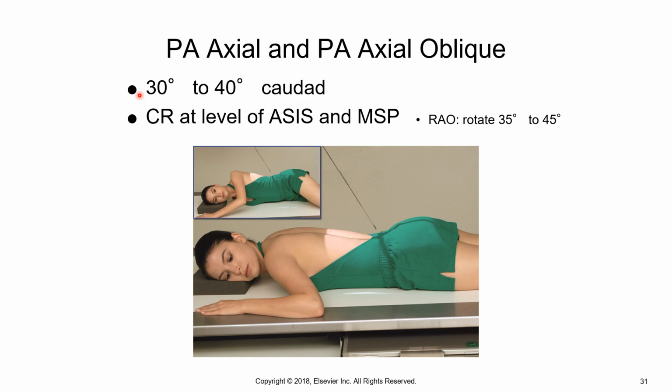And anytime something is opposite, because we just angled 30 to 40 cephalic, when you flip the patient, you would flip the angle. So now we're 30 to 40 caudal if we did this. But out of those 4 that are listed on 535 and 536, we only do one of those views.